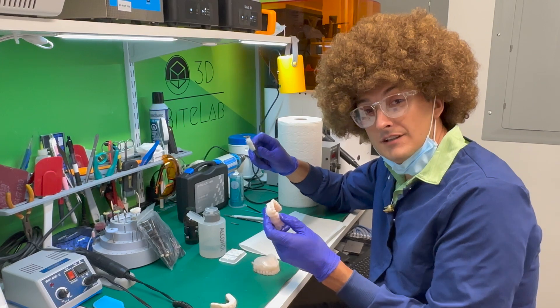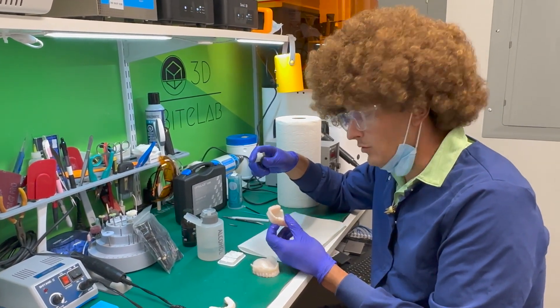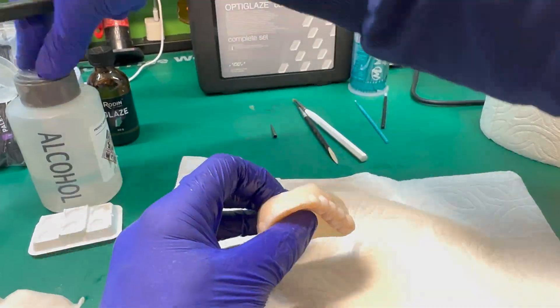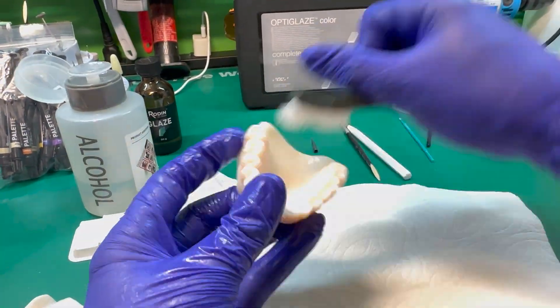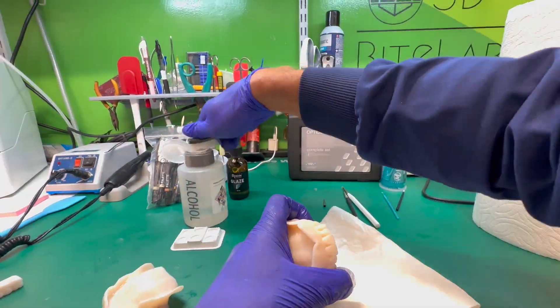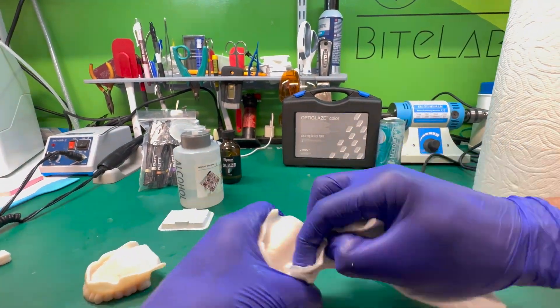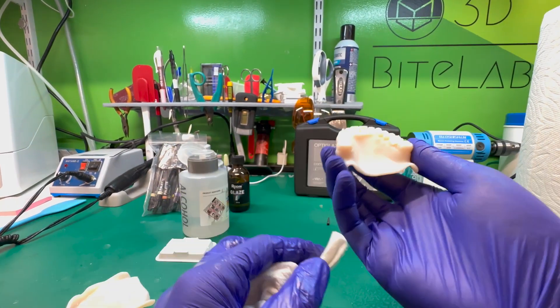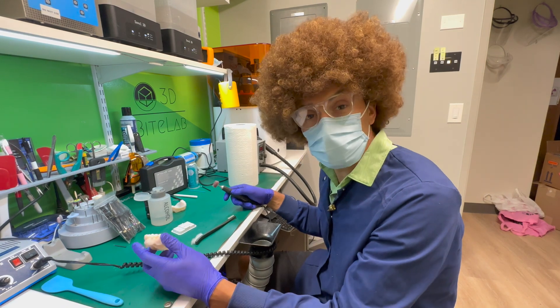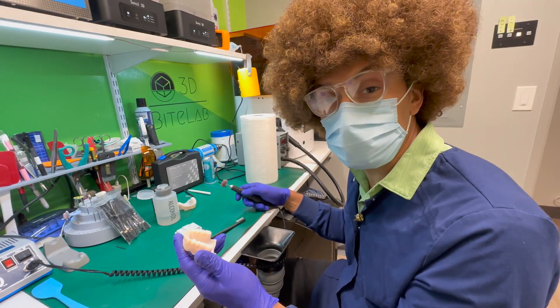Next, we're going to go ahead and clean what's left over here with just IPA on the toothbrush and wiping it up. And then we're going to go ahead and grind down what's left of our support tips. In the next step, we're going to remove what's left of our supports. This is why it's so important to consider the tip thickness of your supports when you are creating your nested file for your print.